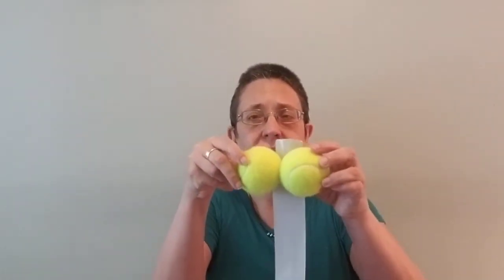So what you're going to do is take a 10 to 12 inch piece of tape, doesn't really matter. It's not rocket science. It doesn't have to be perfect. And you're going to put it on the two balls while they're touching each other, about like this, and then roll the balls in the tape. And take a minute to fold and press the tape down into the crease between the two balls. You want to make sure that your resulting product is much narrower in the center than on the outside where the balls are.